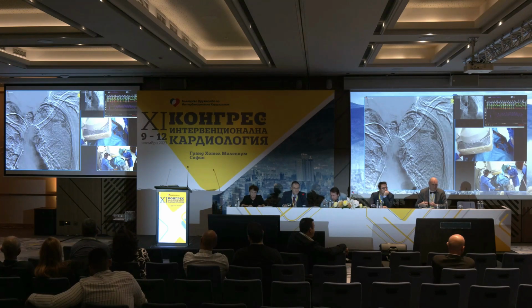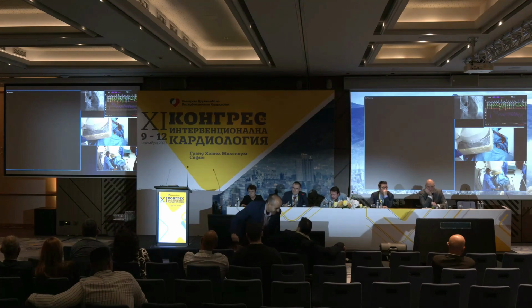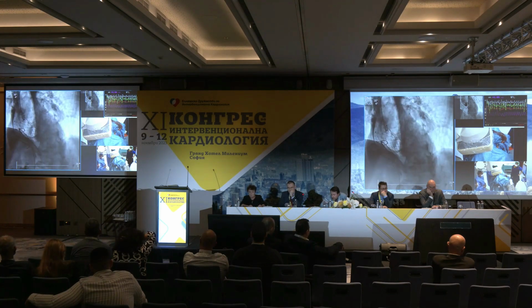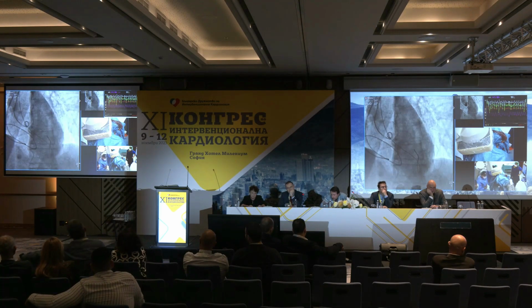Ivo, you're online. Yeah, I'm listening to you. Okay. We are going to show you step by step what we have done. I will start from the behind.